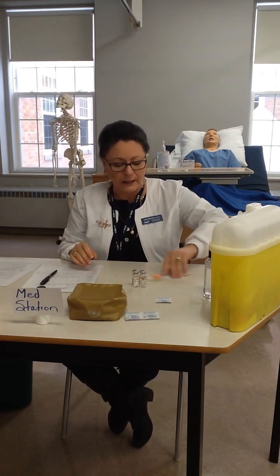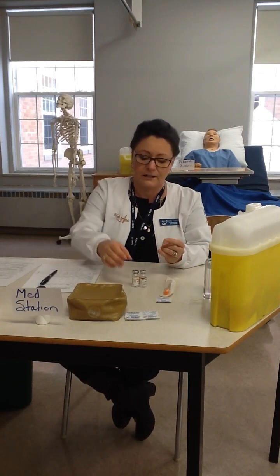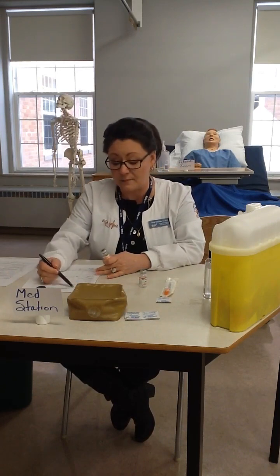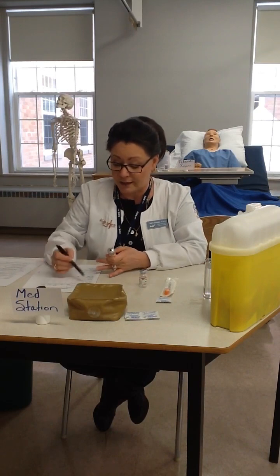And so my first encounter with this medication is my first check. So I'm going to start from the top. I'm going to start with Jesse Moore. Do I have the right patient? Yes, I do. I just came back from having a discussion with Jesse Moore, checked his armband. I know it's Jesse. Do I have the right drug? My MAR says insulin R. My vial says insulin R. I don't have the correct dose yet, but I will as I go along. And I'm going to have a second nurse, or I'm going to verbalize that I would get a second nurse to check my dose each time.